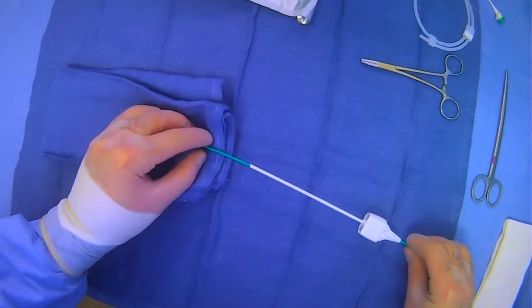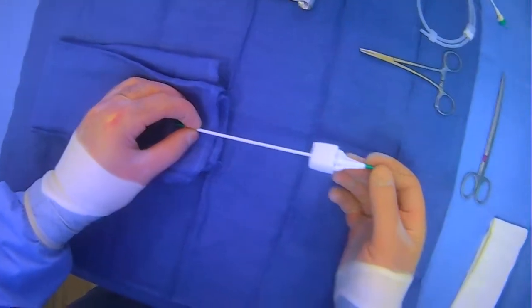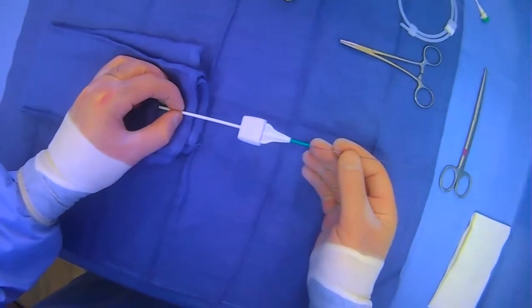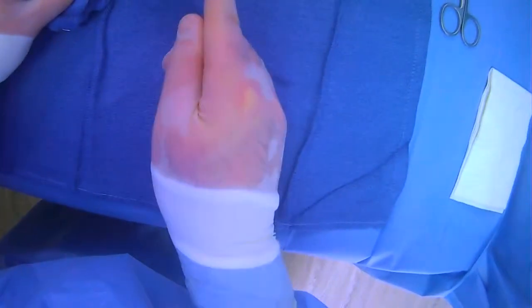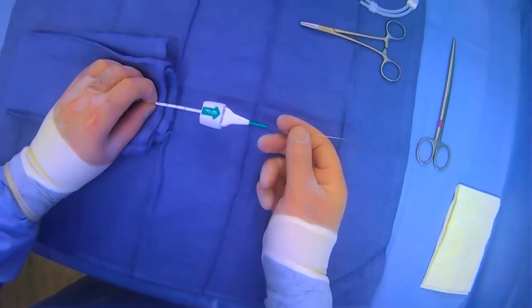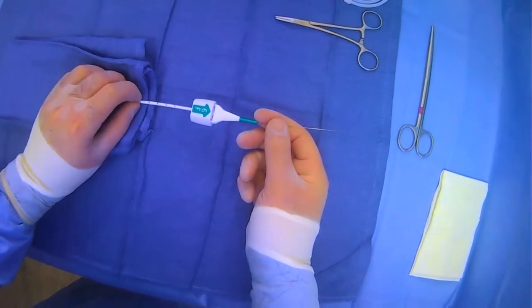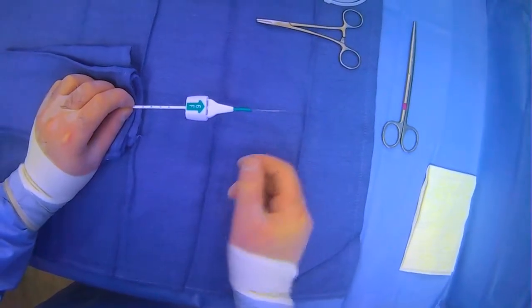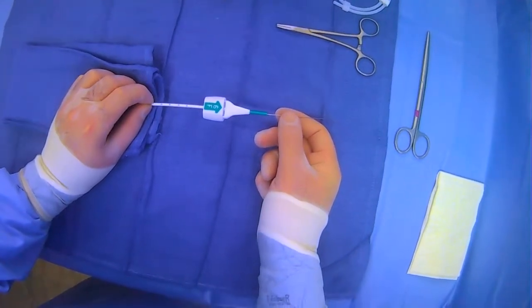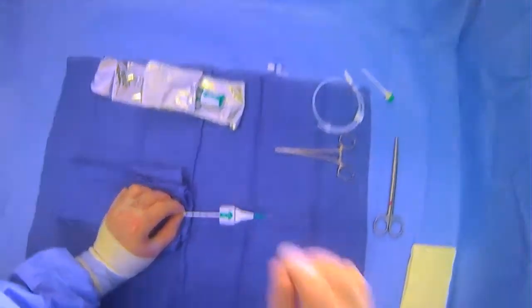We have wire back here, so we'll bring this introducer in in this orientation as discussed before. We'll push it in, and at the point where we start to notice blood coming out of the hole, we flip it over and we can still see the bleeding. This lets us know that we are in the vessel we're trying to close. We then pull back until the bleeding stops, which tells us we're just outside the vessel, and then advance back in until we see bleeding again — this tells us we're right inside the vessel.